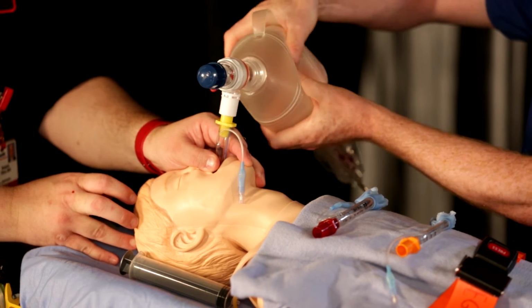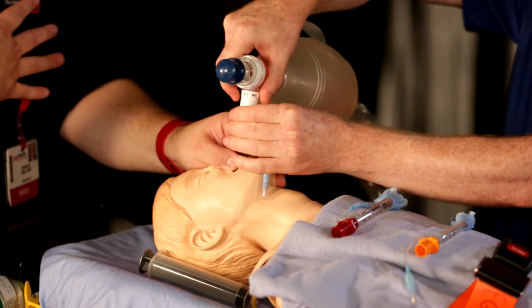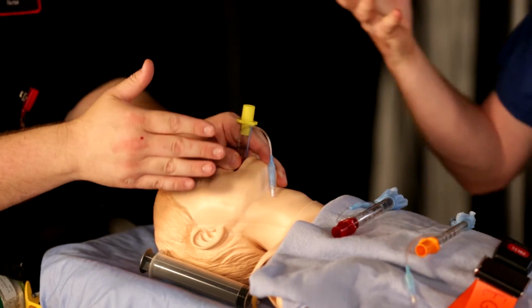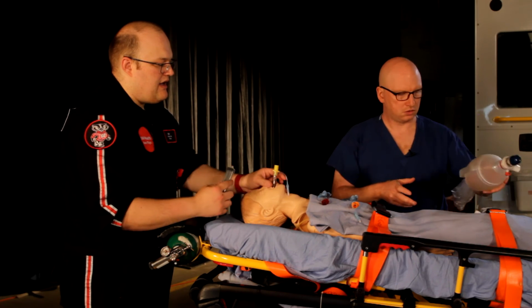Okay. So again, we want to make sure that we're not overly ventilating. We want to see chest rise, but we don't want to see huge excursion. So just enough to see that chest rising, that tells you you've got enough volume. Absolutely.